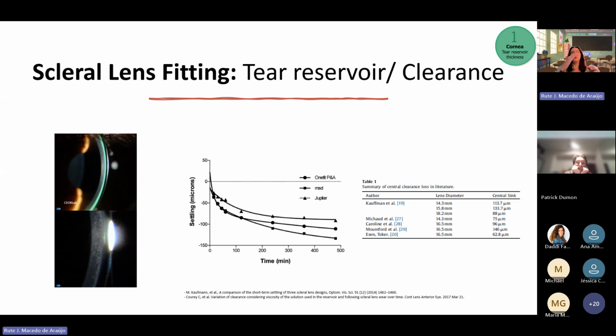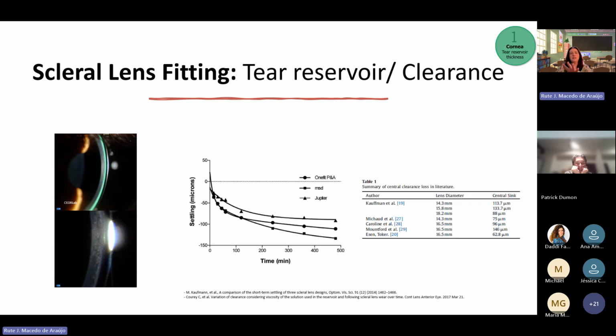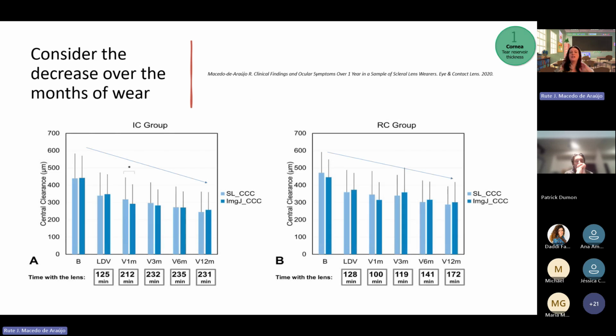Why? Because this will decrease over time. This is well documented in the literature, so we all know that this will happen to our patients. Also, we should consider that during the one year of lens wear, this will also decrease a little bit more over time. During the day, it will decrease about 80 microns, 100 microns, and throughout the months of lens wear, we are talking about 20 microns. So it's clinically less relevant.